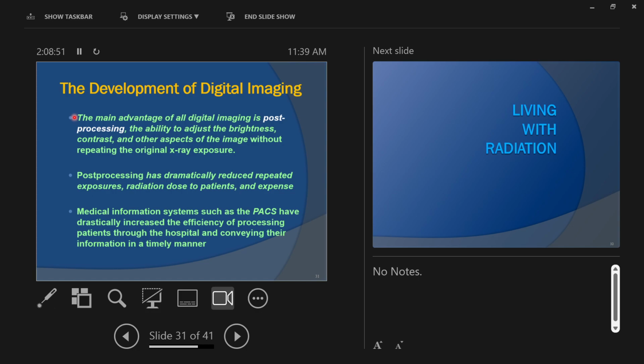Let's say I want to make some of it brighter. What am I going to do? I'm going to turn down the lights in the room, or I'm going to increase the light coming from behind, right? We actually had a separate light that we put on a table called a hot light. It looked like a little spotlight, but it was called a hot light.